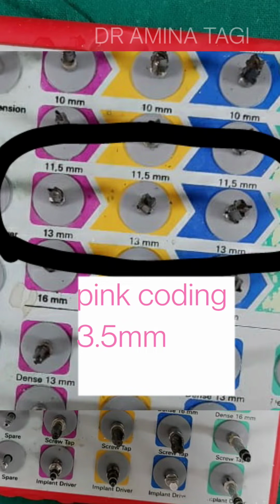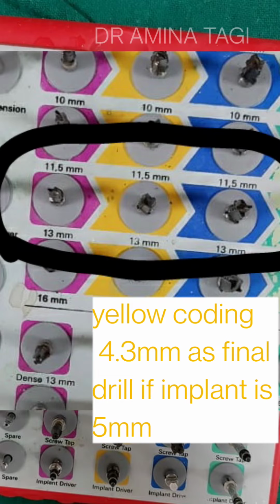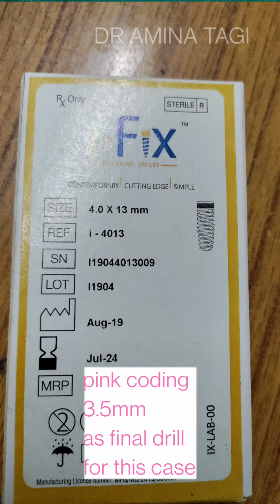See, suppose if your implant was of 5 mm diameter, then we would have taken the last final shaping drill as 4.3 mm. After drilling with the pilot drill, we would have gone for 3.5 mm, then again for 4.3 mm, if our implant was of 5 mm diameter. But here, since the implant is of 4 mm diameter, the last final shaping drill is 3.5 mm.